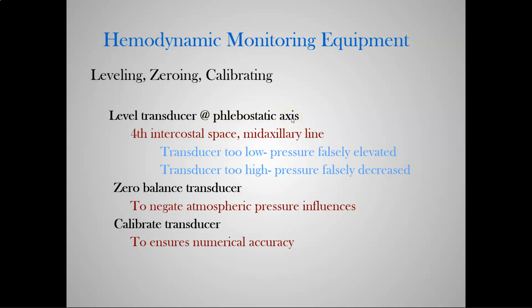More often than not, and depending on where you work, depending on what kind of beds you have, I like to attach my transducer to the patient themselves so they can tolerate it, or to the bed. Because when you're moving the patient up and down to clean them, to move them, to roll them, to do your 2 hour turns, to do oral care, to do VAP care, whatever the case may be, and you move and manipulate that bed. If you have it attached to your IV pole, that's fine, but that means you also have to re-level it every single time you move the patient. Whereas if you have it attached to the bed and the bed goes up, it goes up with the patient. So keep that in mind.